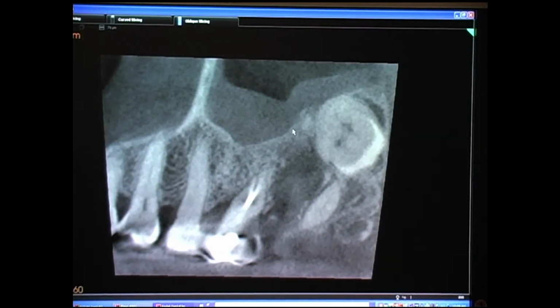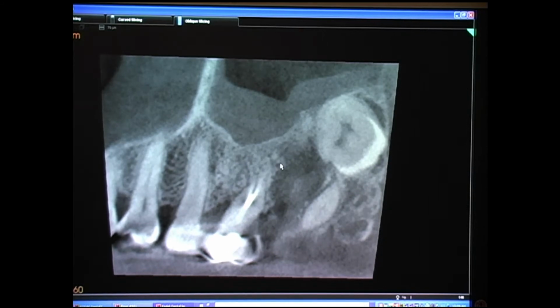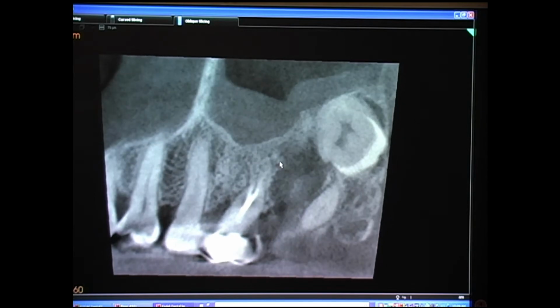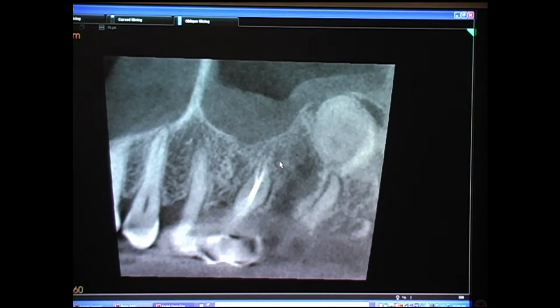Chair time, if I could use that term. Now there's more time that's used in using the software and planning treatments and evaluating the data, but in terms of patient flow, it does not take very much time.